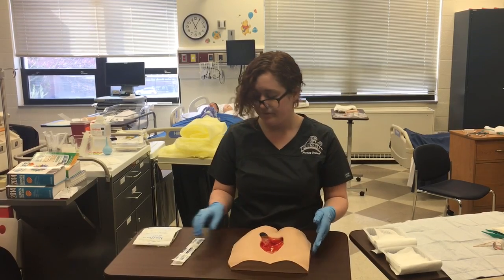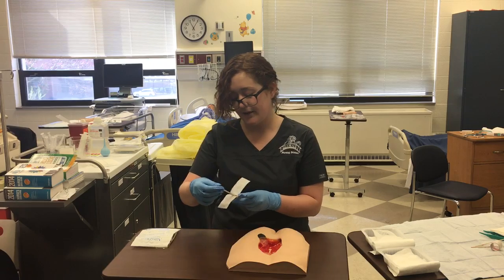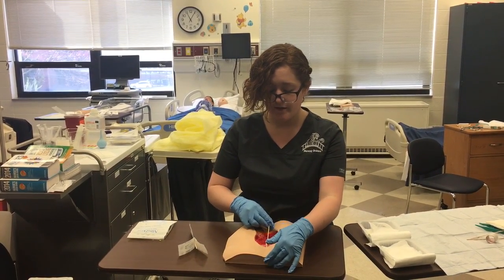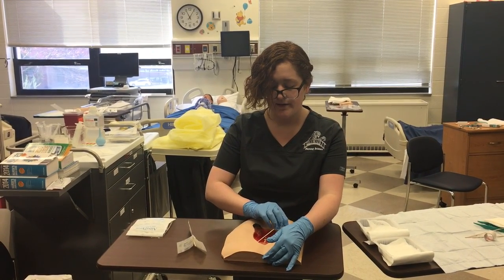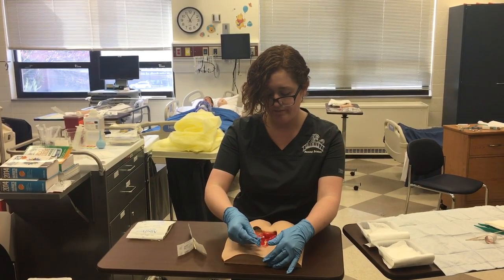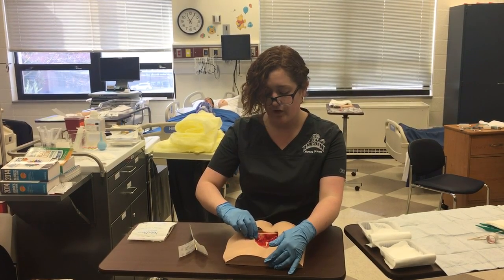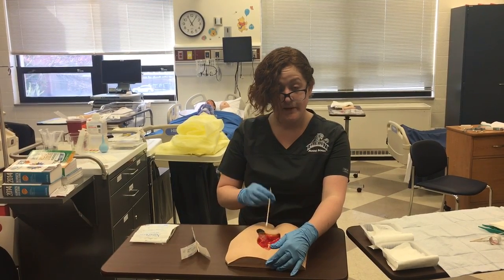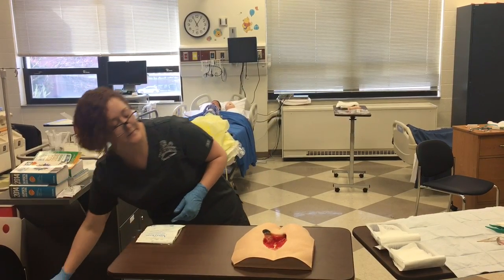Once it is clean, I am going to open this second set of cotton tipped applicators. Only need one. And I'm going to check for tunneling, measuring it in centimeters using a paper measuring tape that I bring into the room with me. and I'm going to be going around in a clockwise fashion, so 12 o'clock, 1 o'clock, 2 o'clock, and so on. I'm going to document any of my recordings. I'm going to dispose of that.